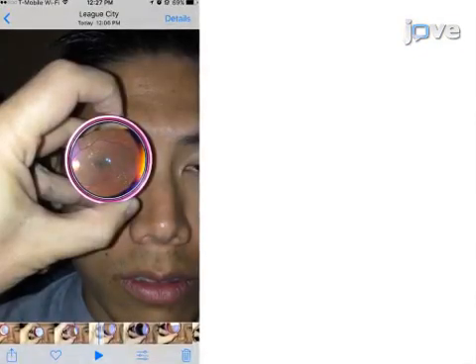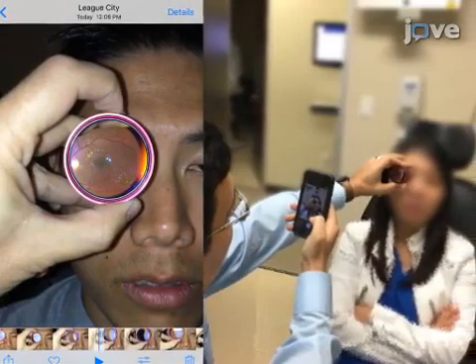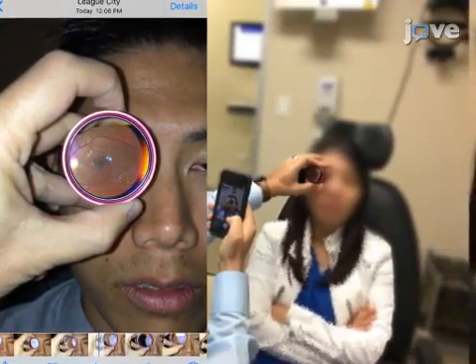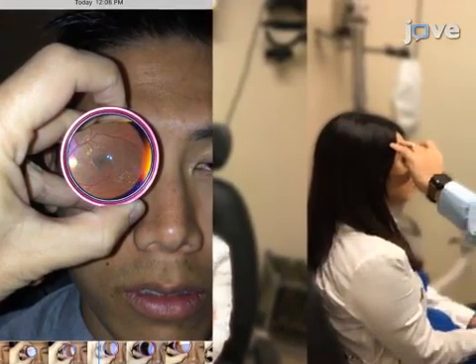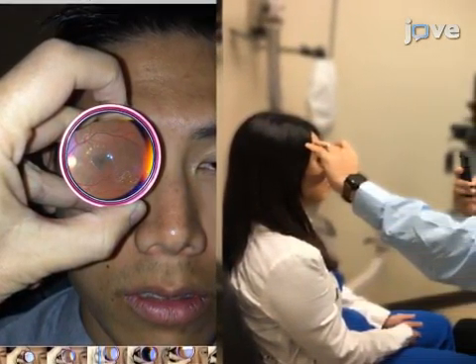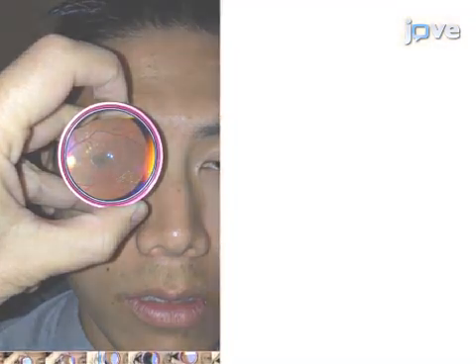With increasing availability of smartphones and the expansion of telemedicine, this method can be adapted by ophthalmologists and optometrists to document retinal pathologies in emergency room setting and telemedicine consultation for retinal diseases. In addition, healthcare providers may find this method handy in developing countries and in medical aid camps during a disaster rescue operation.